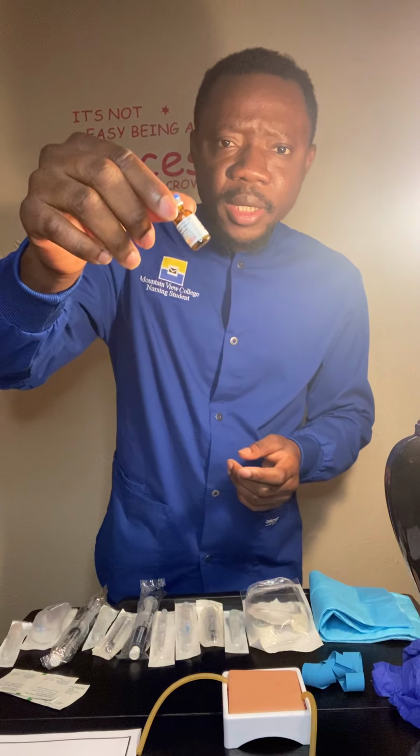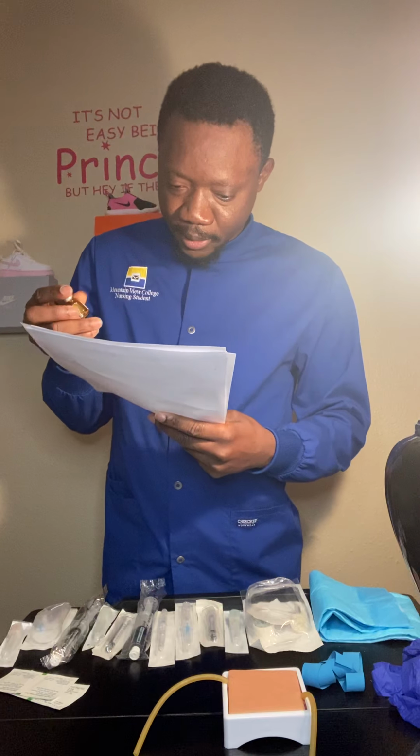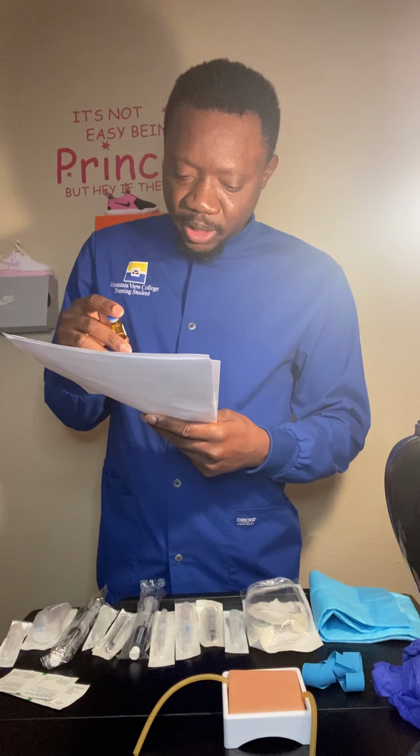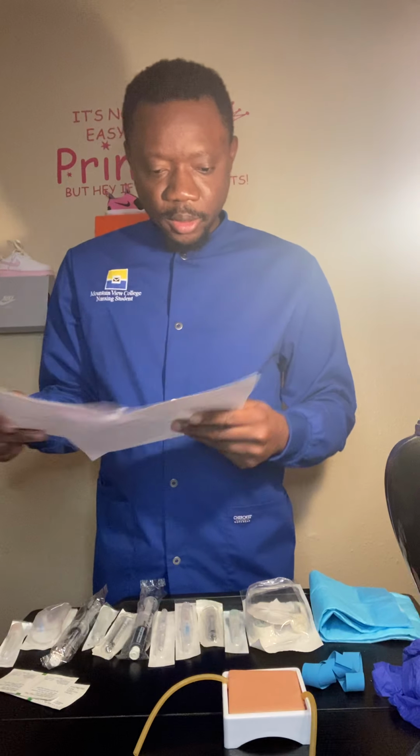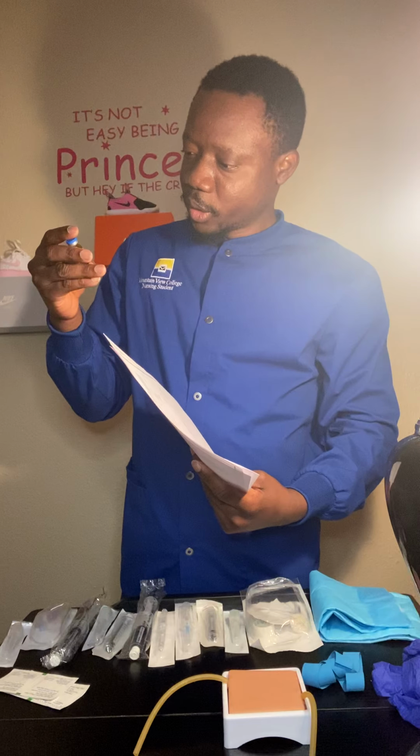This is my Mepridine. I don't know if you can see it. Okay, so let me check again. I have Mepridine. 50 mg is ordered. I have 100 mg, so I'll do my calculation, which I already done, and I'll be giving my patient 0.5 ml because I have 100 mg in 1 ml. The doctor ordered 50 mg, so 0.5 ml. So right medication, right route, right dose, right patient, and right time. So this completes my first check.